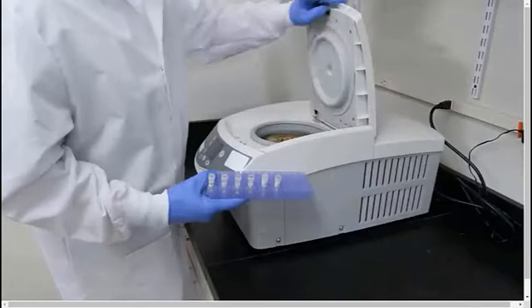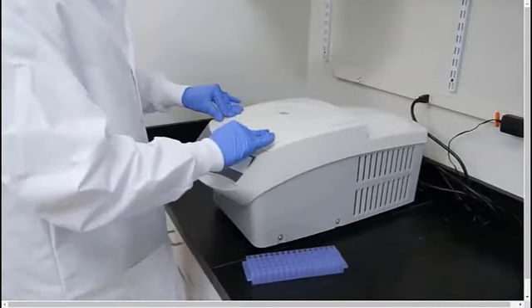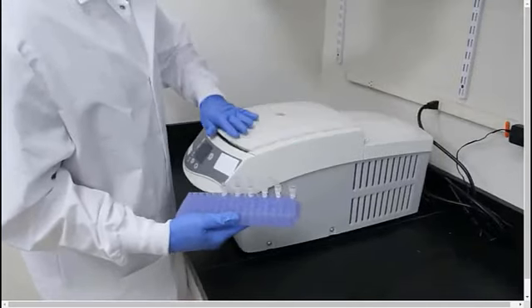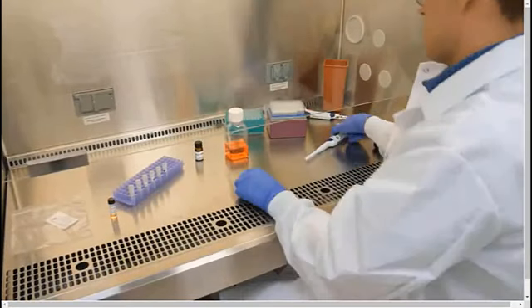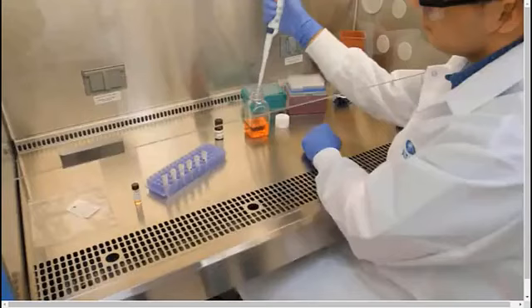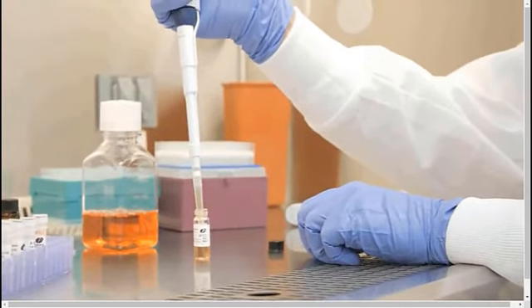Because the organoid growth kit components are provided as powders, briefly centrifuge the vials to ensure that the contents of the tubes are not stuck to the walls or caps of the vials. Following the instructions provided, reconstitute the individual components in the correct buffer. Typically, this is either in media or DMSO. Mix thoroughly by gently pipetting up and down.